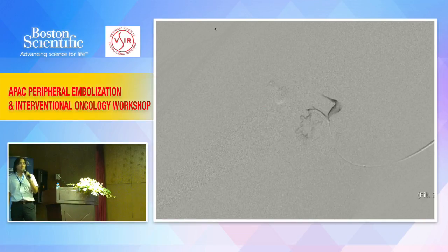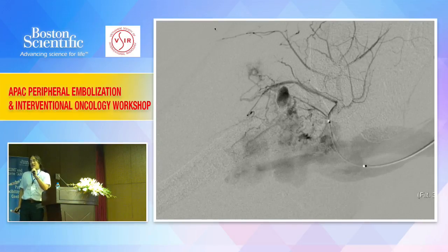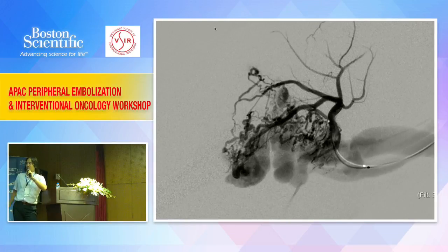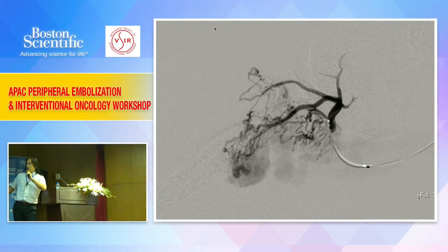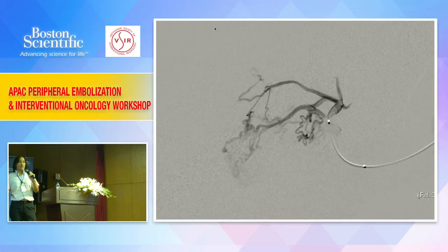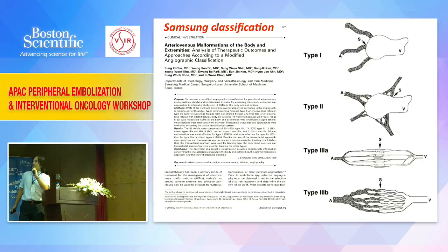And this is a selective angiography. This image is better to recognize the nidus. Maybe here is the nidus, with many feeding arteries shunting to the vein. Also around here is a nidus. So in one AVM, there are several nidi. So we need some kind of common classification to talk about the nidus.